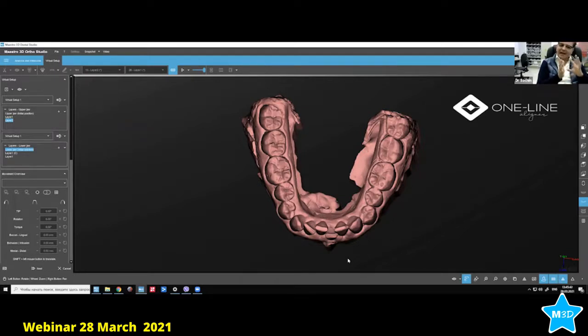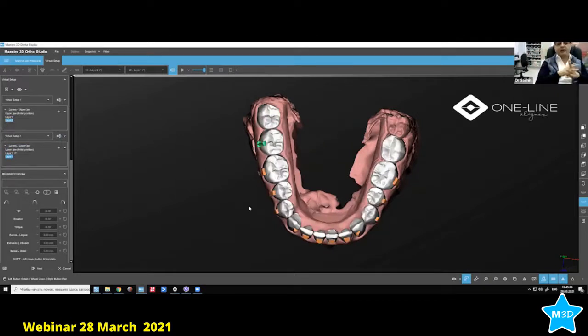Yes. We do start sometimes with CA and then go on to Pro Plus, or we start with Pro Plus and then we go on to CA. The reason, in some cases, like the first case which I showed you with a very minor rotation, sometimes the Pro Plus is very flexible. Even after the compensation, the overcorrection that you have done, it just might not do the movement completely. So then I go on to CA.